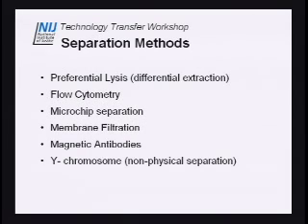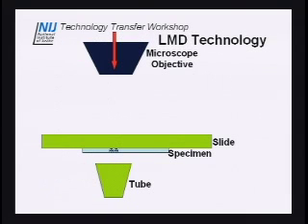But it's very different. Statistically, of course, you won't get as good a power of discrimination as you would if you were able to do your STR loci, your 13 core loci. So we propose, of course, that laser microdissection is an alternative method for separation of sperm from epithelial cells.